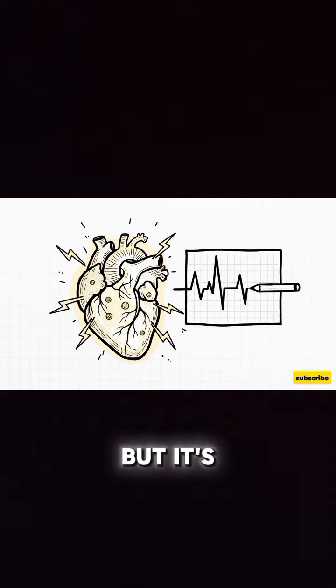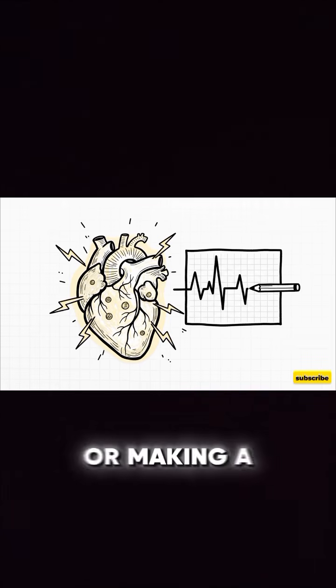It's a huge word, but it's absolutely vital because before you can even think about spotting some subtle abnormality or making a clinical diagnosis, you've really got to respect the raw data collection. This is just the pure physics and physiology, literally capturing the heart's electrical current over time.